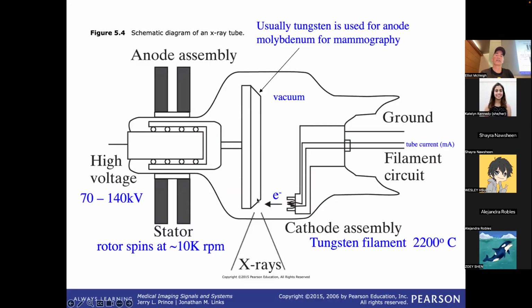If I hit my target here, I'm basically going to get a sphere of X-rays coming out in all directions. And we just conically aim them with collimators and stuff like that to make a beam come out. And you just absorb all the rest.